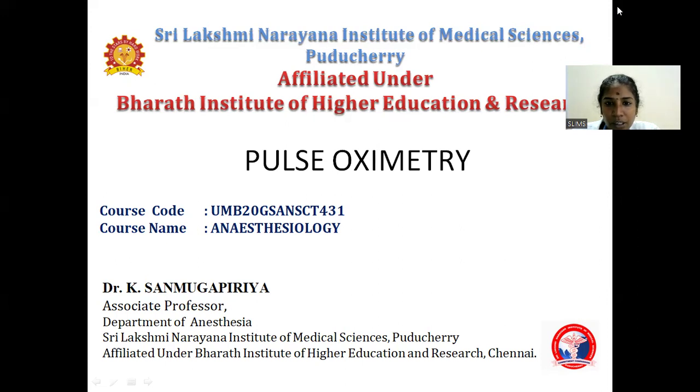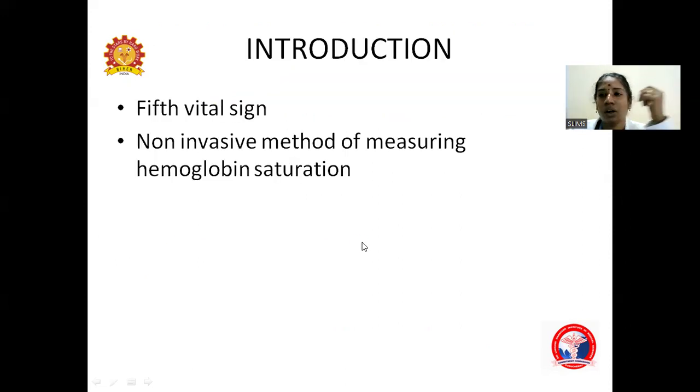I'm Dr. Sanmugapiriya. Today's topic for your class is the pulse oximeter. So, what is a pulse oximeter? Where is it used? Any idea? Yes, day to day in the OT, and once the patient is admitted in the hospital, to assess the saturation, we will be using the pulse oximeter.